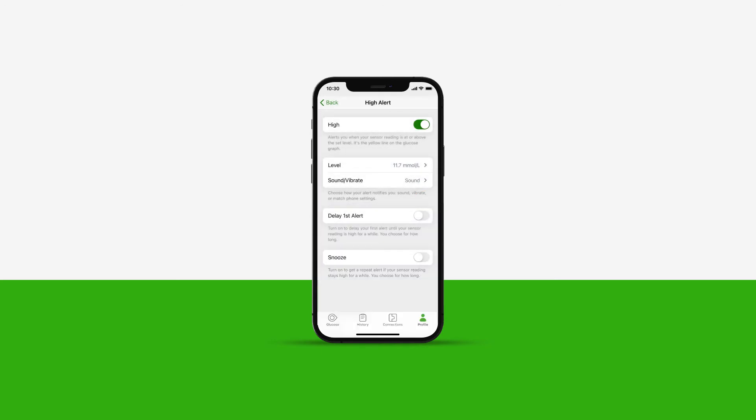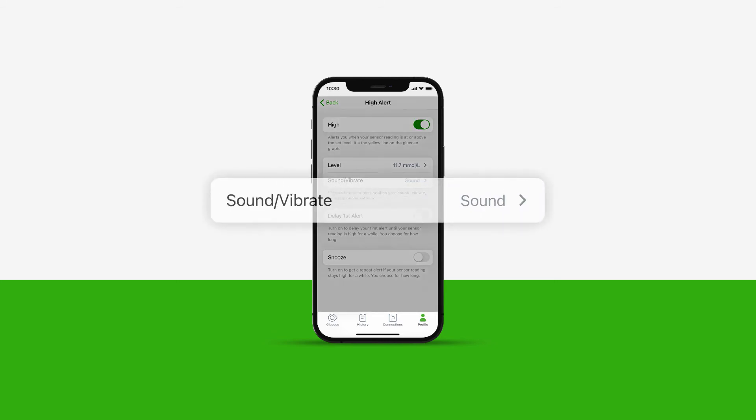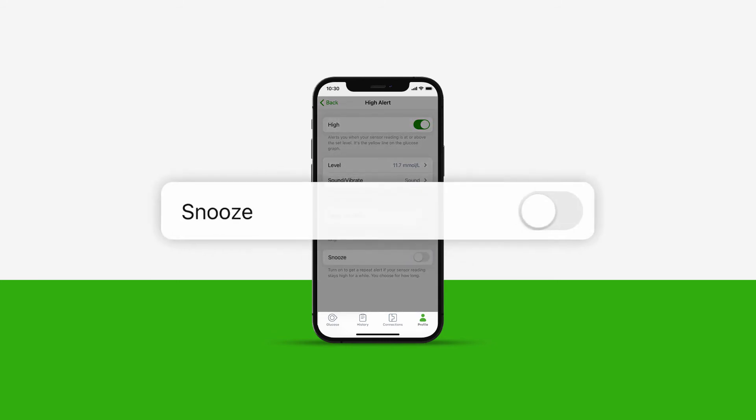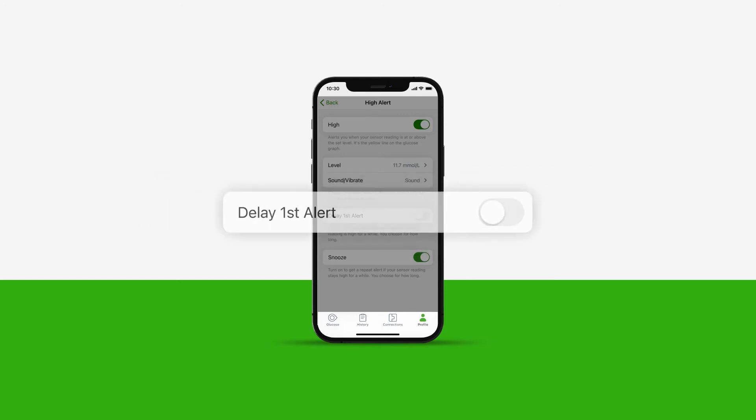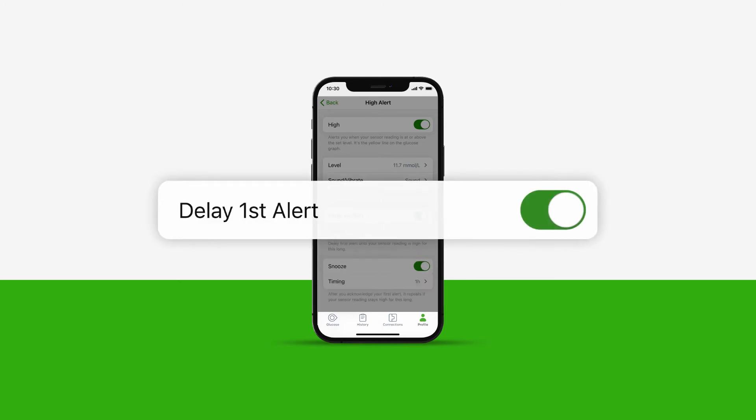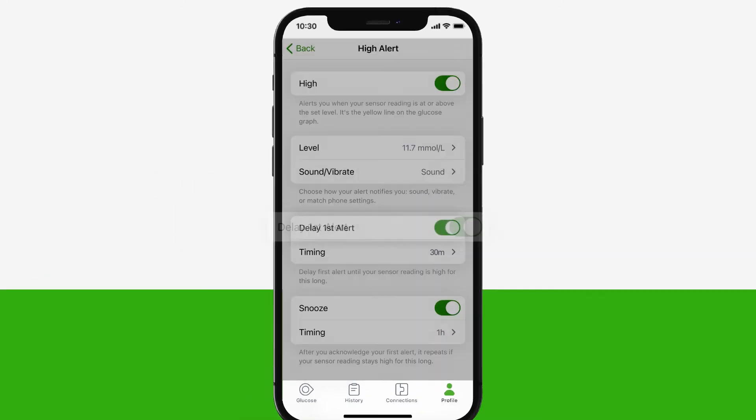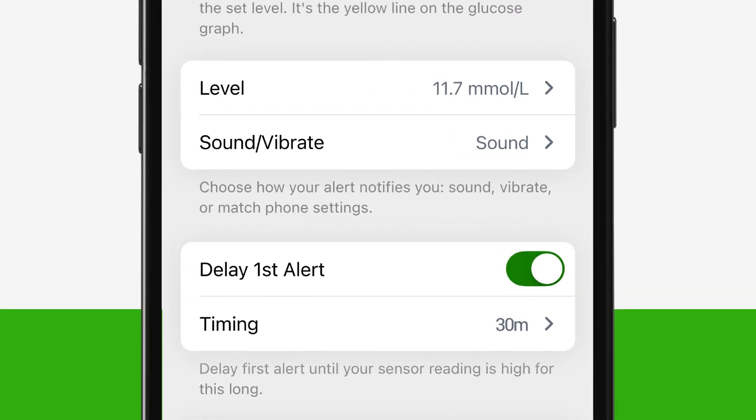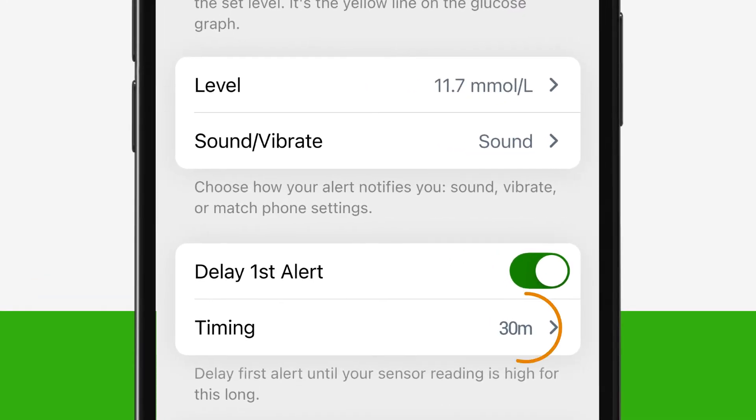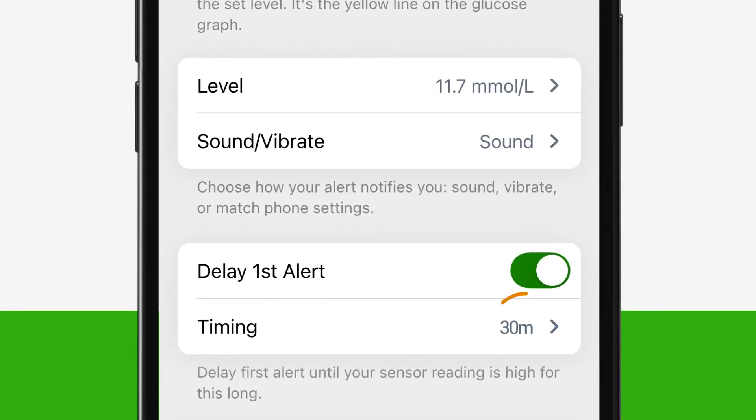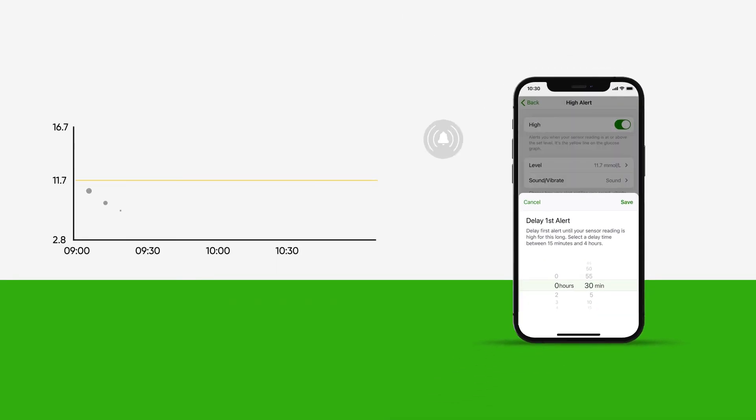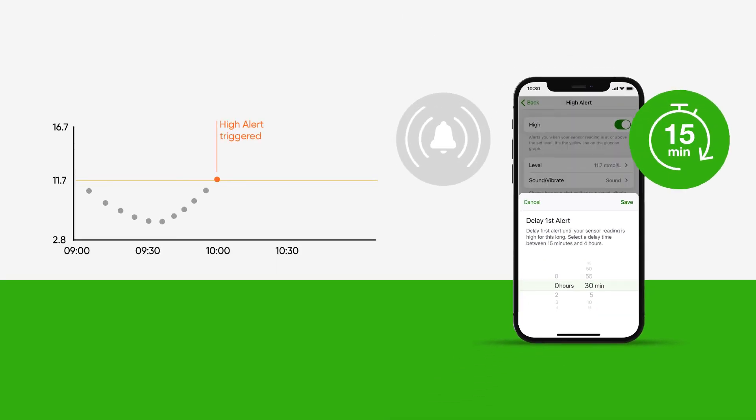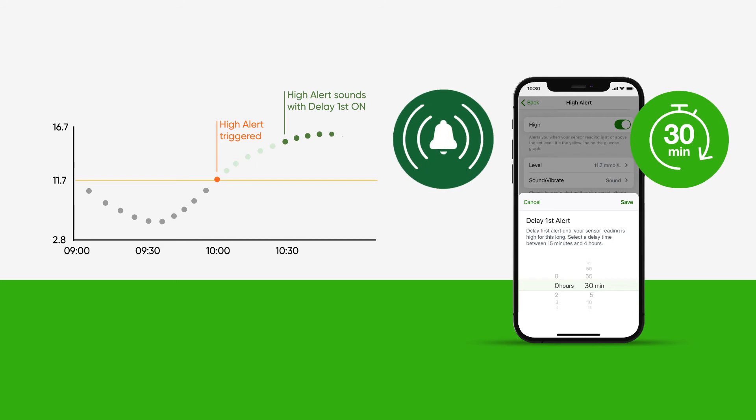In your high alert menu, you can also customize the alert notification and snooze for your high alert, just like the low alert. You have the option to delay your first high alert until your sensor reading is consistently high for the amount of time you choose. For example, the alert will not sound until you have been in your high range for over 30 minutes.